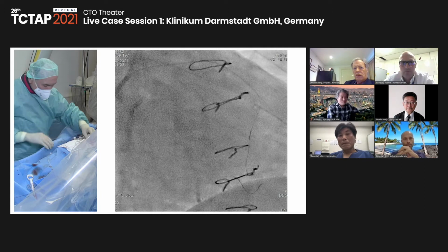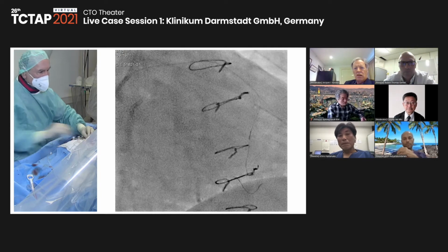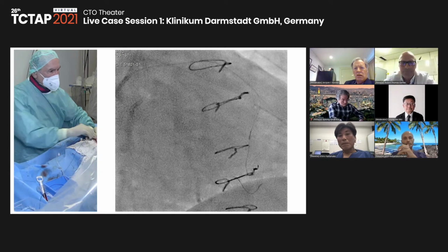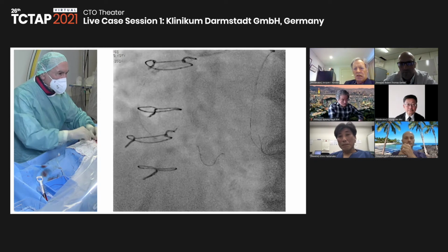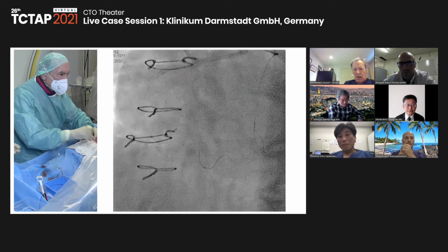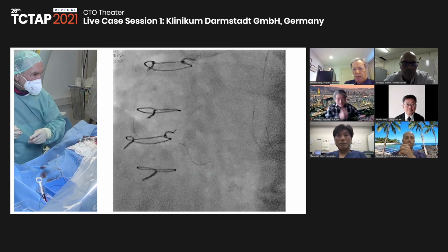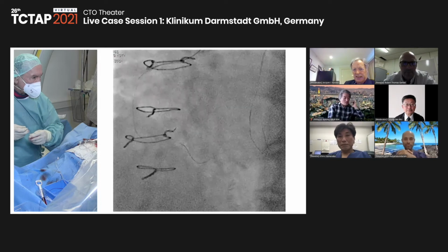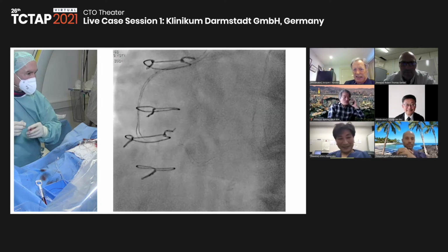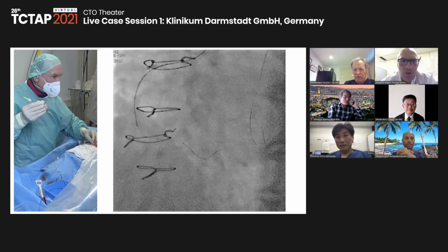I did a foolish thing. I just removed my right coronary access. Okay. Should be able to get back there. Okay. We have a channel. That sometimes happens. That's what happens in the middle of the battle. Middle of the transmission. Yeah. It's okay. You can blame us for distracting you.